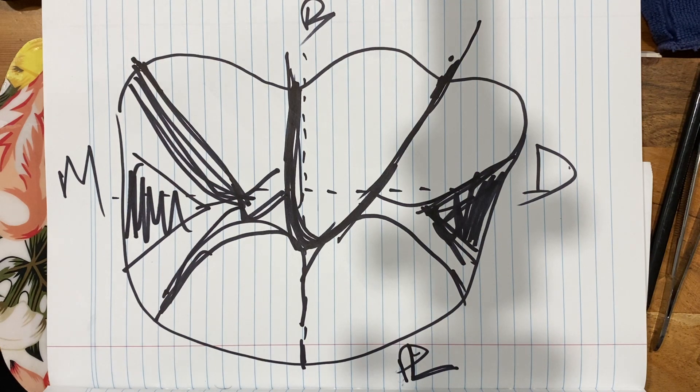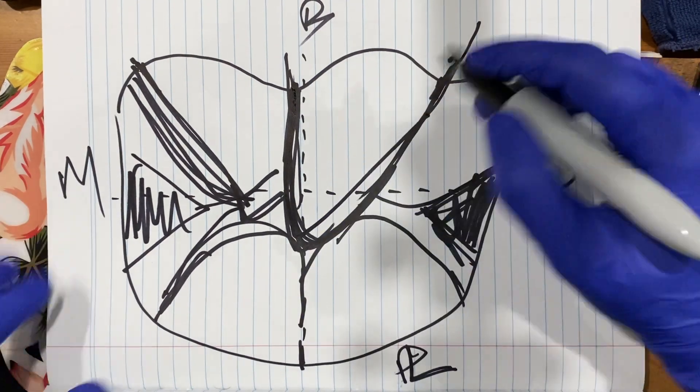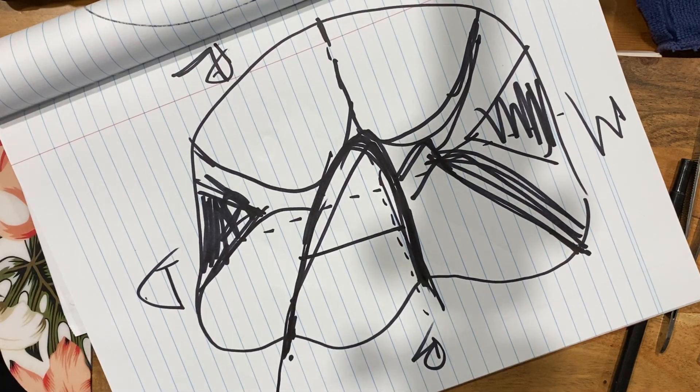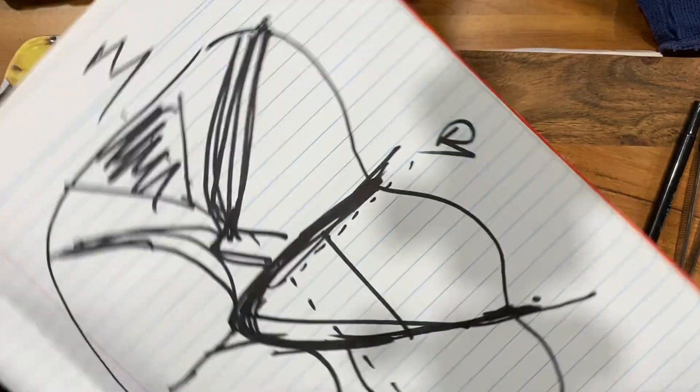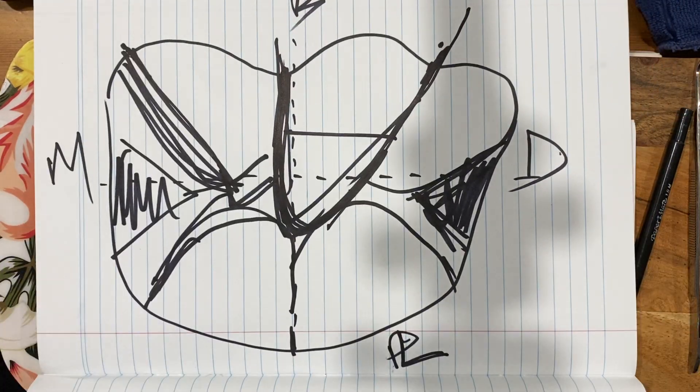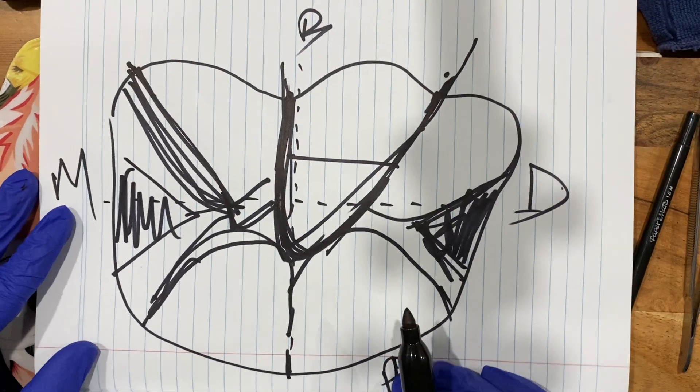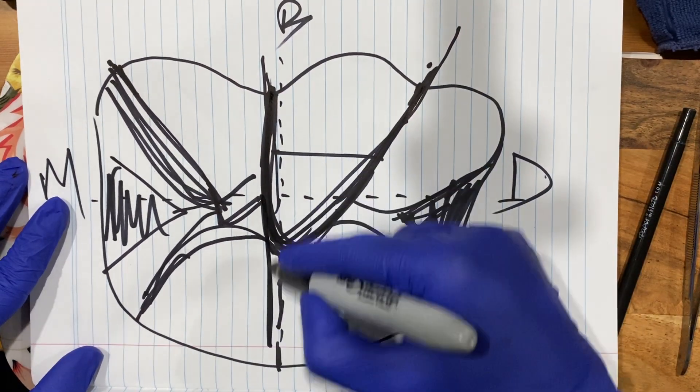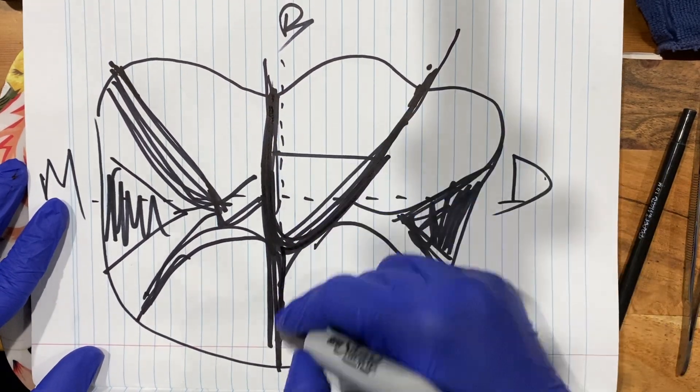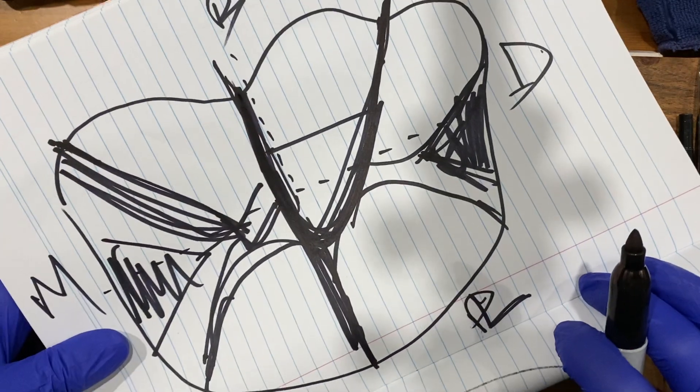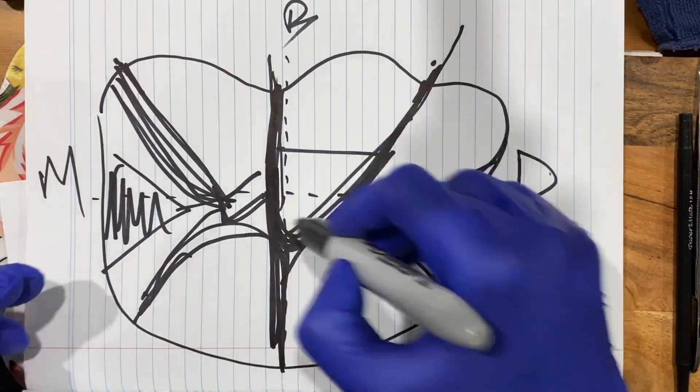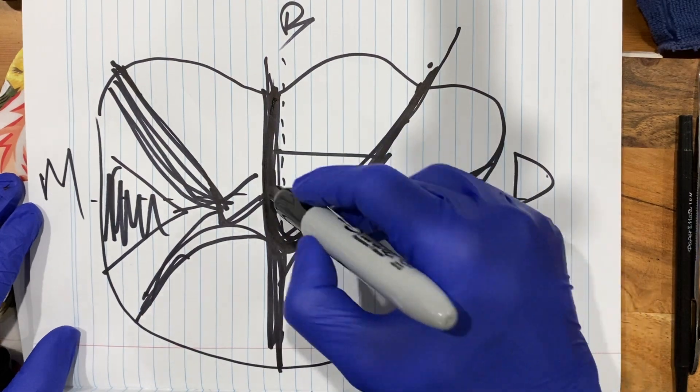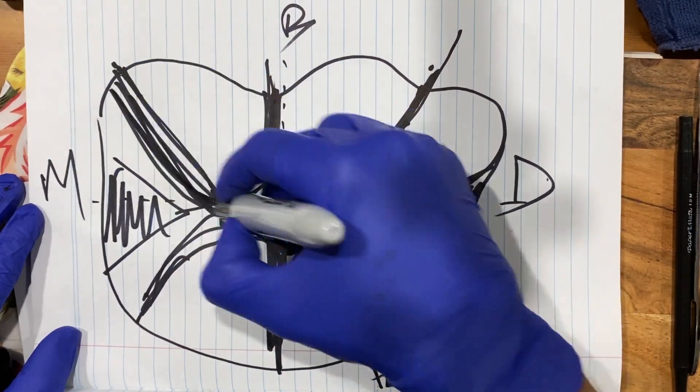So never try to recreate anatomy. Get your A right. If you turn it like that, that's the A that we talk about. Now a lot of people, you might see they say it's more of a Y, not an A. So the way they say a Y is, can you see how this forms? So they say it's a Y. But either A or Y, making sure, get this right. If you get this right, following it along, everything becomes better.